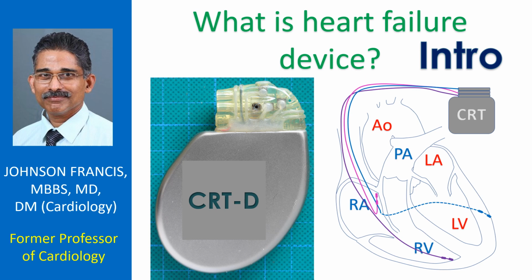An important device used to support the failing heart with reduced pumping capacity has been called heart failure device, but the correct technical name is cardiac resynchronization therapy. It is not to be used in all types of heart failure, only in specific subgroups of heart failure.